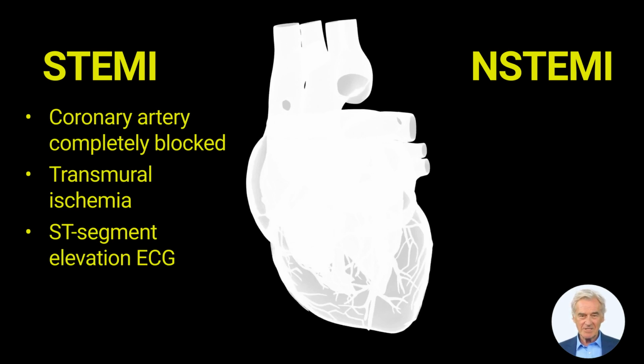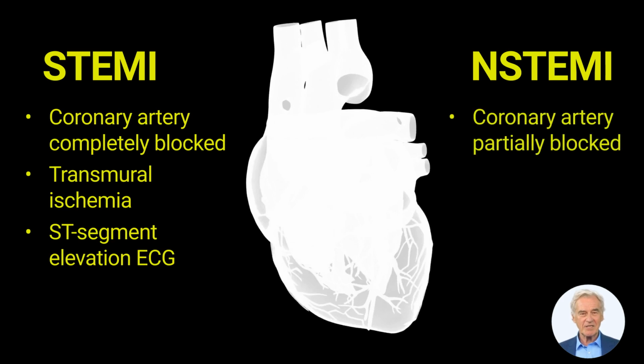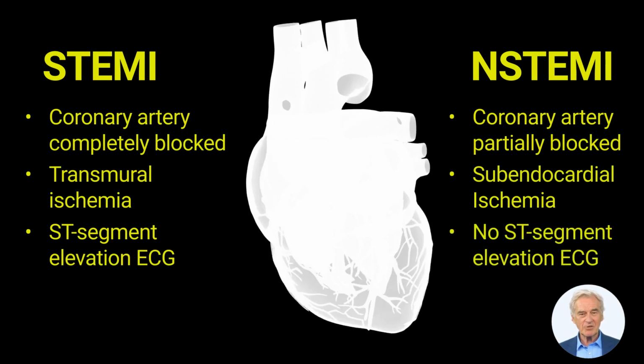In contrast to STEMI, non-STEMI, or non-ST-Elevation Myocardial Infarction, is characterized by partial blockage of a coronary artery or temporary reduction in blood flow. This results in ischemia that affects only the innermost layer of the heart muscle wall, known as the subendocardium. This type of ischemia is called subendocardial ischemia and does not exhibit ST segment elevation on an electrocardiogram.